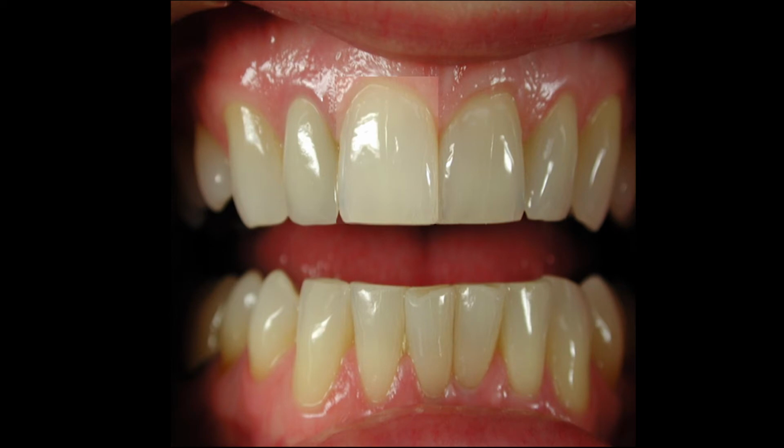Then we're going to fade in another picture where we darkened it. It looks low in value compared to the natural central. Then we're going to fade back in to the proper shade, which is the natural looking tooth. You notice how you start to pick whether it's bright or whether it's dark, and we're not worrying about those other color spectrums of hue and chroma. You really need to hone in on this and make sure that you're picking that proper shade, that proper value.